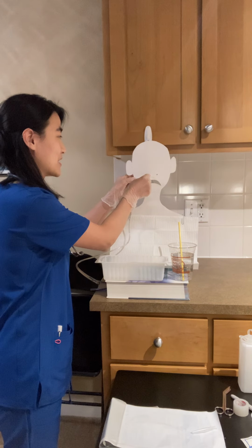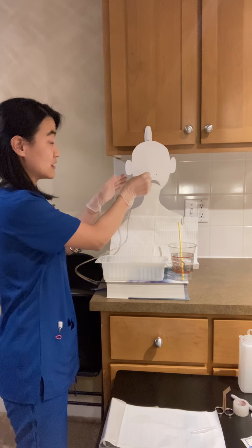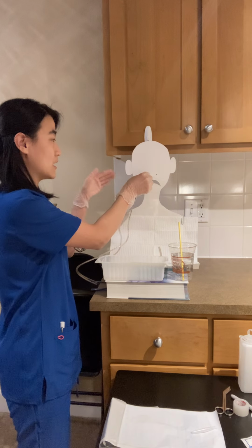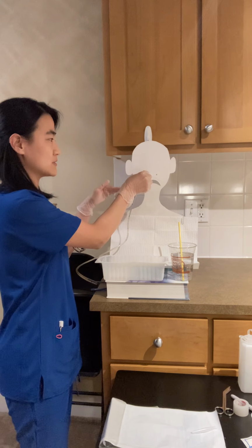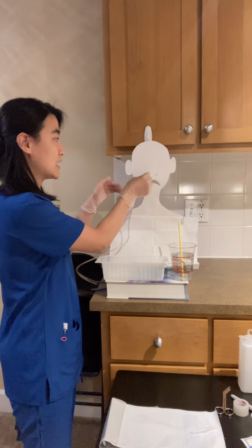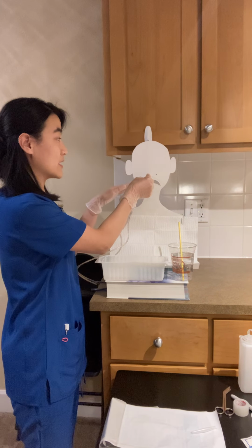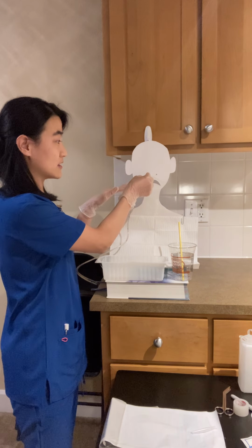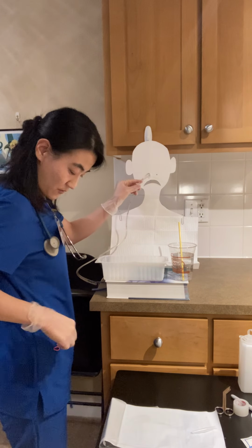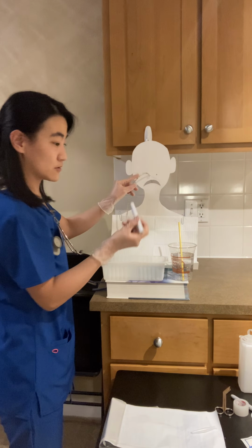Alright, and then just a note, in an actual procedure I probably would not be holding his head like this. This is just a very flimsy mannequin, but in the event that there was any resistance while I was inserting the nasogastric tube, or he started gagging or coughing, or his vitals started to change, I would stop, draw back on the tube, and wait until that resolved before I continued.